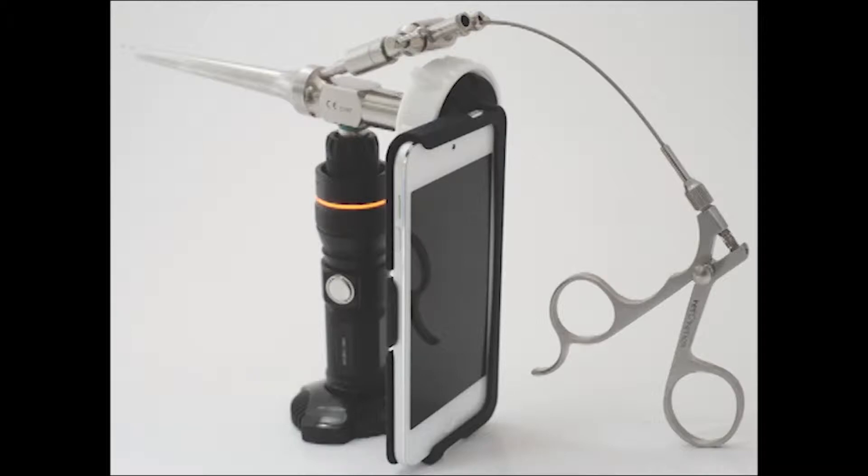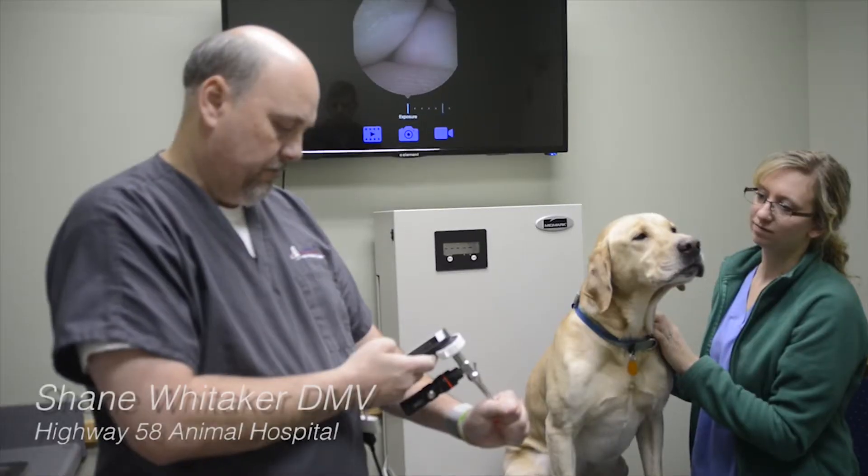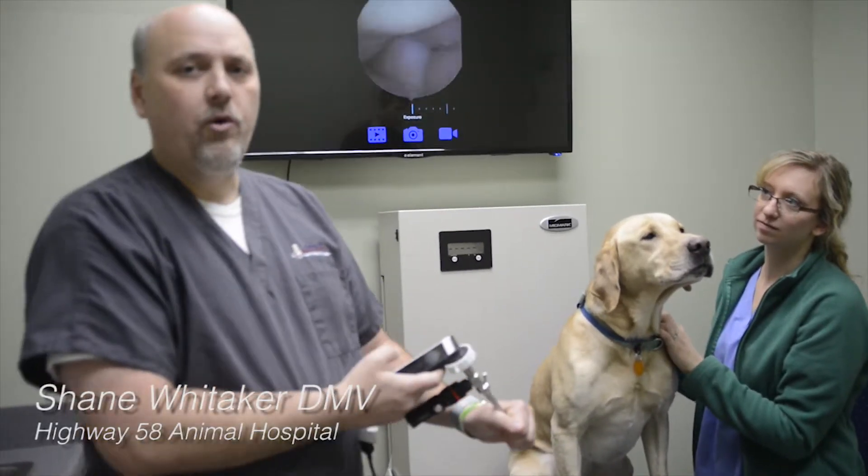The VideoScope is a simple-to-use system that attaches a scope to your iPhone or iPod Touch for otoscopy, rhinoscopy, and rabbit intubation. The scope magnifies the image times 30 and has a working channel to take a biopsy or remove debris.